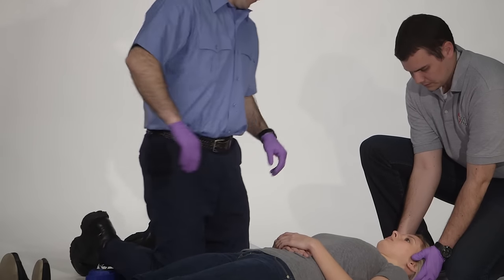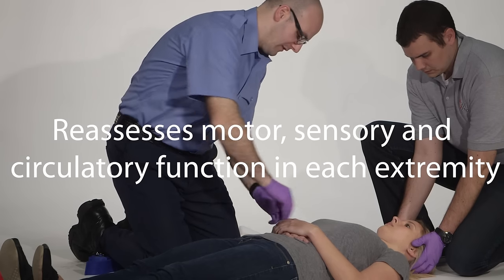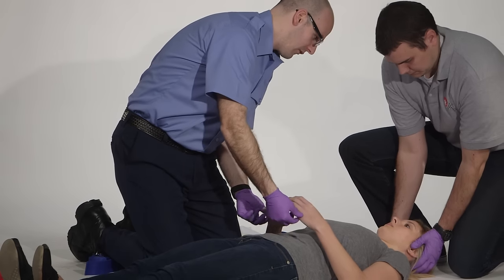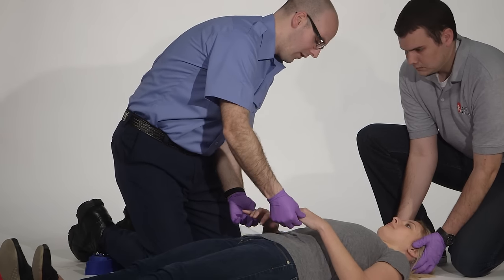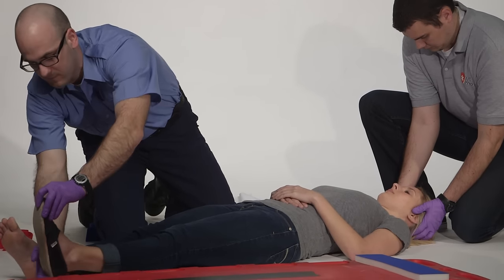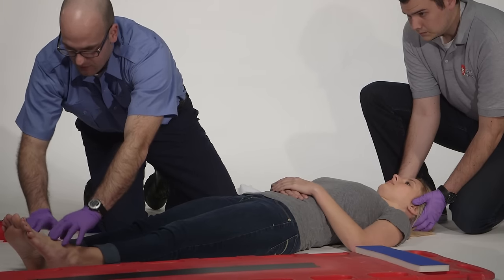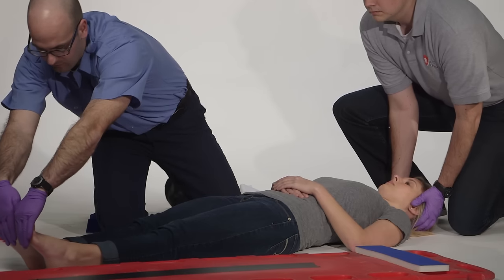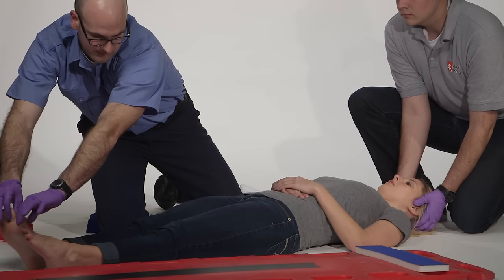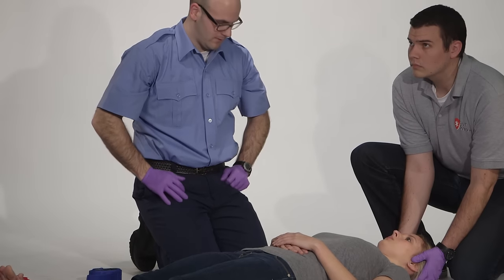Once he's doing that, I'm going to check CMS. I have bilateral pulses. Can you squeeze my fingers for me? Awesome. Can you tell me which fingers I'm touching here? My pinky. Now I'm going to move down to the feet, take the shoes off, and check pedal pulses. Can you push down against my hands? Perfect. Now pull back up against them. Can you tell me which toes I'm touching? My big toe. Pulses, sensation, and motor function are intact in all extremities.